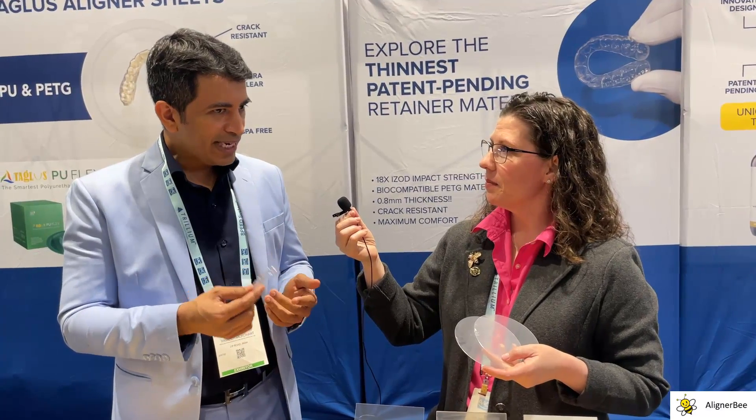And what thicknesses is the PU-Flex available in? So in millimeters it's 0.45 millimeters, 0.76 millimeters, and one millimeter. In U.S. terms, that's 020, 030, and 040.